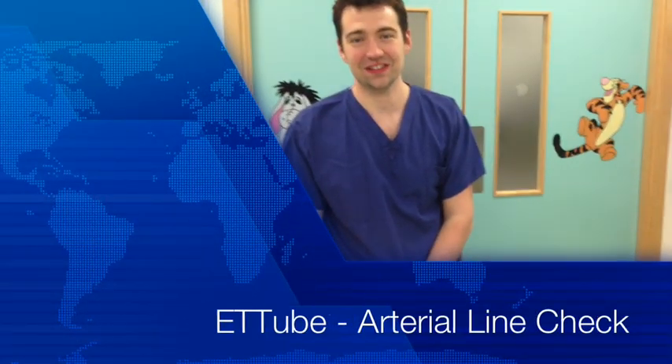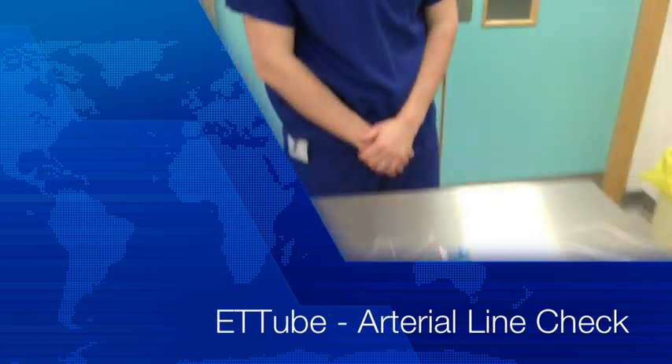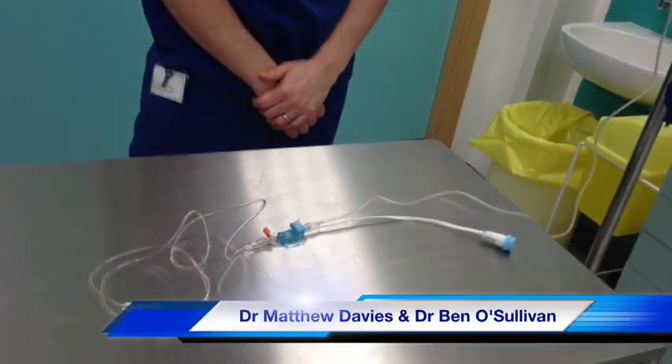Hello. Hi there. Could you please identify this piece of equipment? This looks like an intra-arterial direct arterial blood pressure monitoring system.